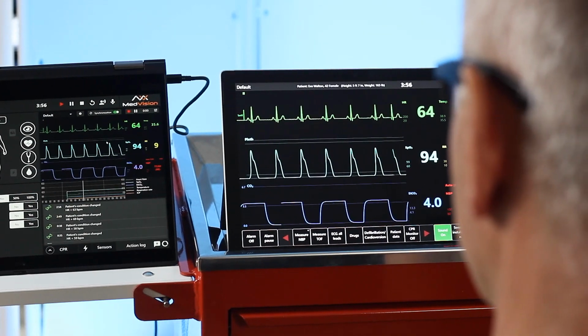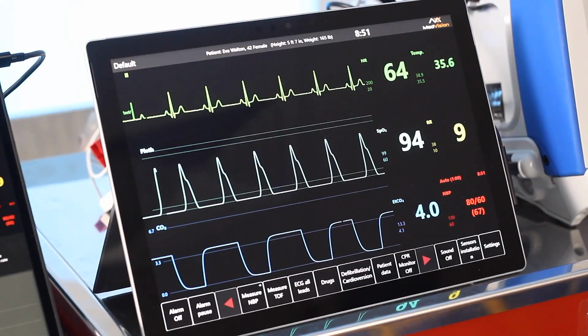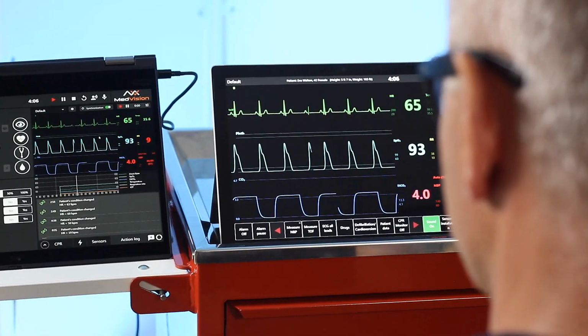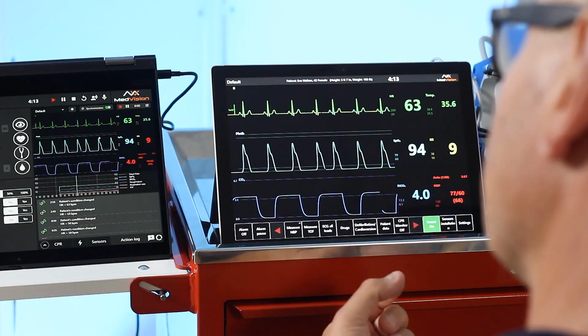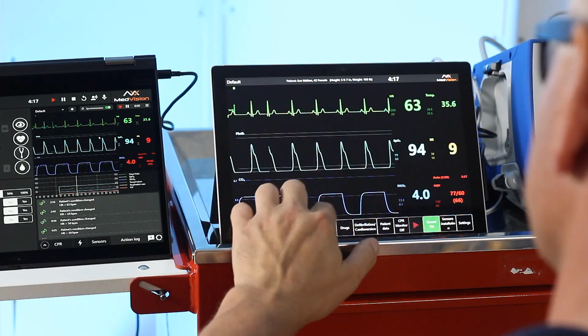and that sounds like the clinical piece of equipment taking that. We've got this set on an automatic cycle every 1 minute. We can change that up to every 5 minutes or have it on manual if we wish to. We can measure the train of four, so if you're thinking about anaesthesia scenarios, that will be a function that's available. And we can generate a 12-lead ECG from the rhythm that we have activated on our scenario.